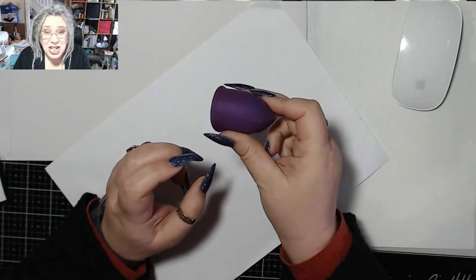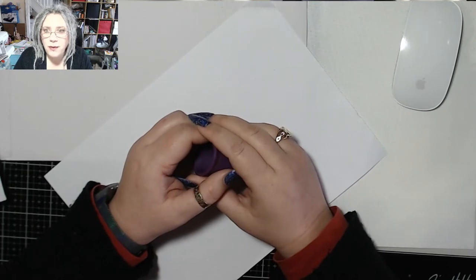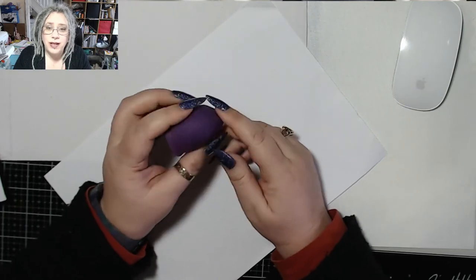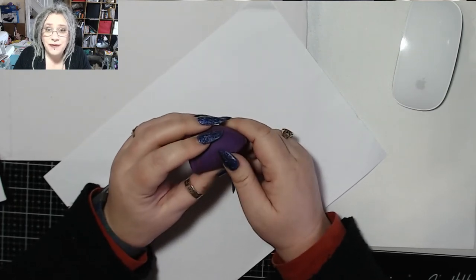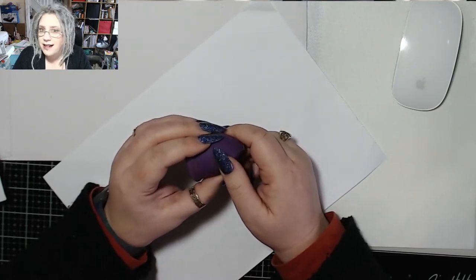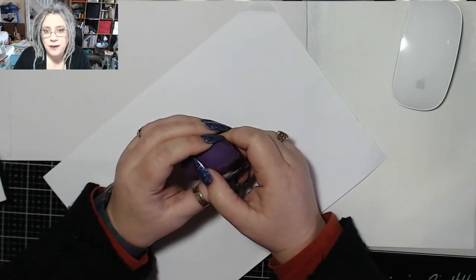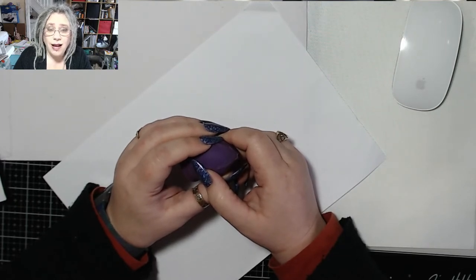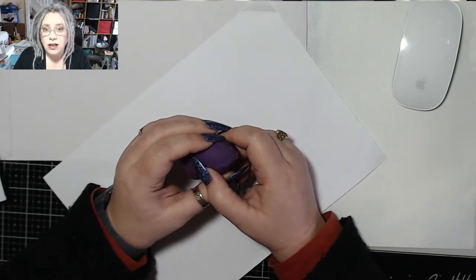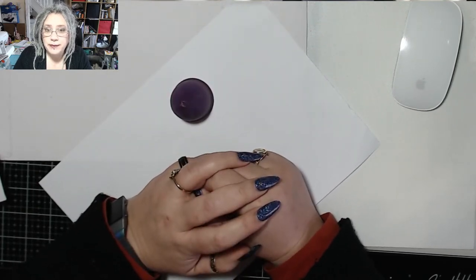They're better for the environment and they're cheaper. This thing cost me 20 quid. Some of them are quite expensive, but this one cost me 20 quid. I've now used it for 15 cycles — that's 15 cycles where I've not bought tampons, not used towels, not used panty liners, anything like that. I've not bought any menstrual products for just over a year. You work out how long a box of tampons lasts you during a period and how much they cost — I've spent 20 quid and that's it.